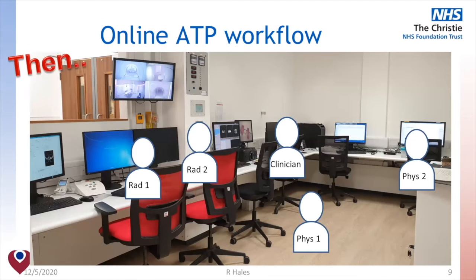So this was our initial workflow for the first 2 patients treated at the Christie, and following this method, a clinician-light framework of working was developed for prostate adaptive position treatment. So this was moving the clinician to an on-call position.